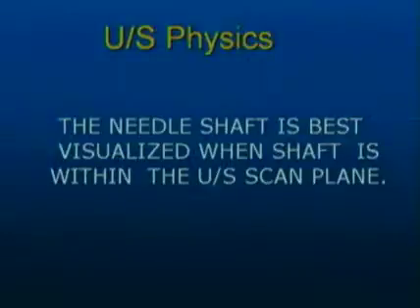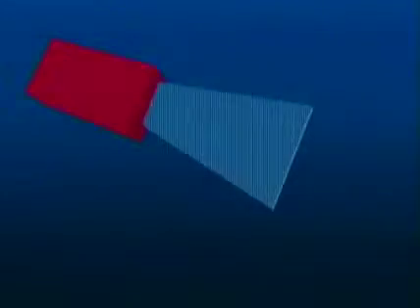Just look at ultrasound physics. The needle shaft is best visualized when it is within the plane of the ultrasound scanner probe. What we're trying to do is put the needle parallel to the ultrasound plane, not perpendicular, when I do most of these procedures. What I'd like to do is put the needle exactly within the scan plane, such as this.